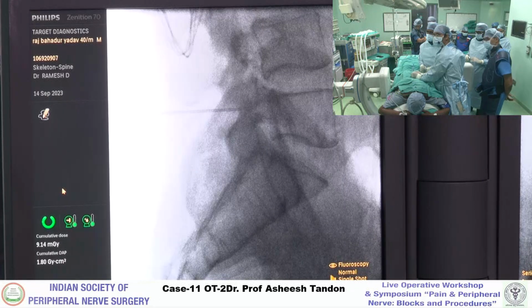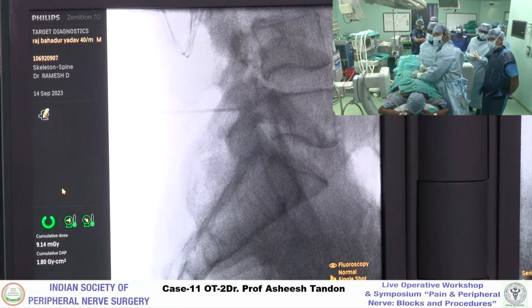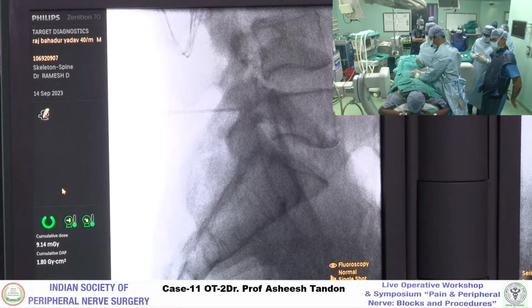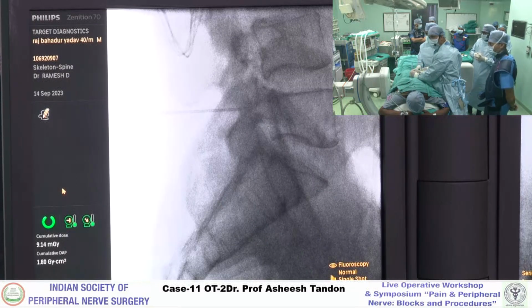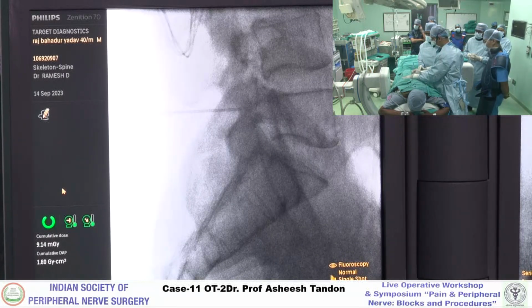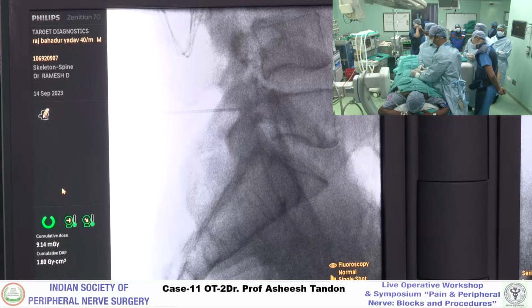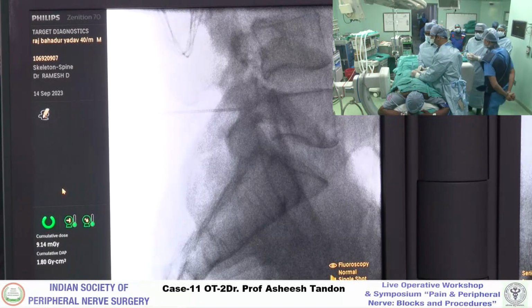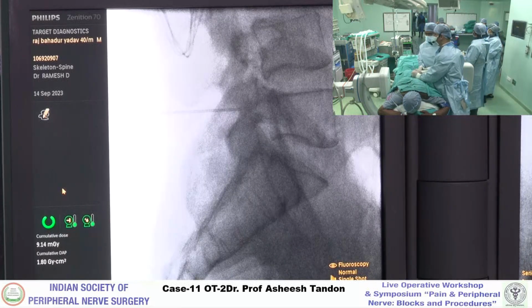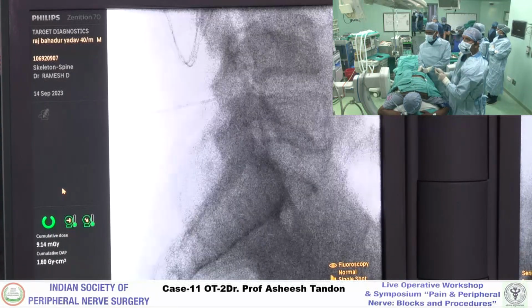Yes, not the spinous. Spinous process is called. हाँ वो हो सकता है. हाँ बस sorry. That is the wincing you were talking about? No. I just tried to pull out because we were not at the right level. हाँ एक मिनट शूट करनी है. हम कहाँ पर हैं देखें.